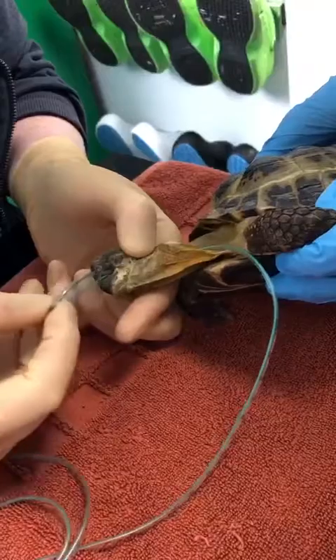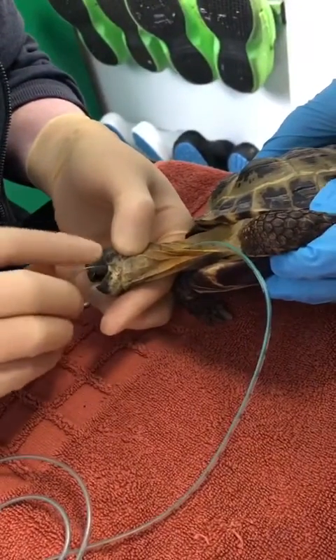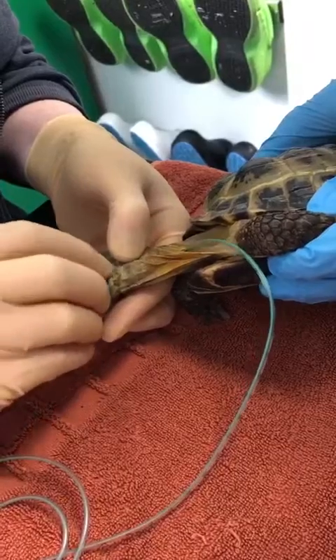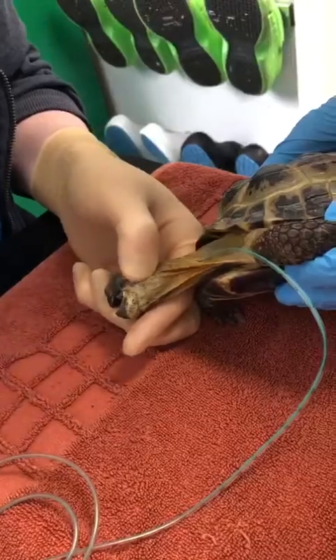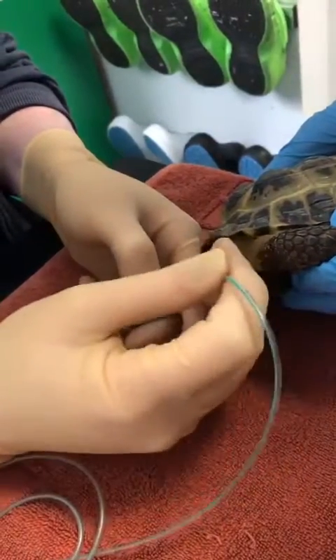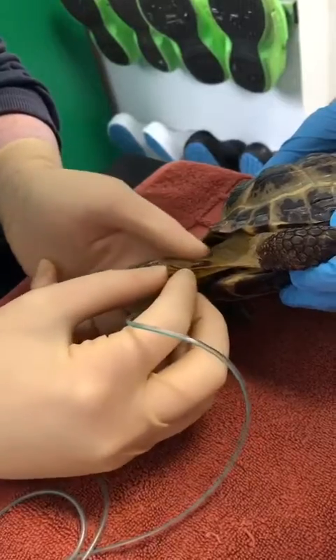We then turn the tube round and put it back down the tortoise's throat. Just feed that back down and make sure that it's in place. If you tug this end ever so gently, it will flip round, and then that's in place.